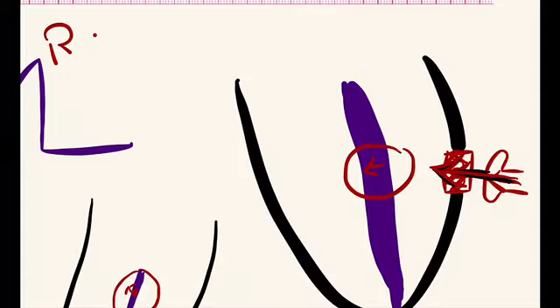Okay, there is no hole in the heart. I am not talking about a hole, but there is some electrically neutral tissue there which has no depolarization wave. And what we are seeing, we are only seeing the depolarization waves. We can only check the vector. So because of this neutral window, we can see the septal depolarization.